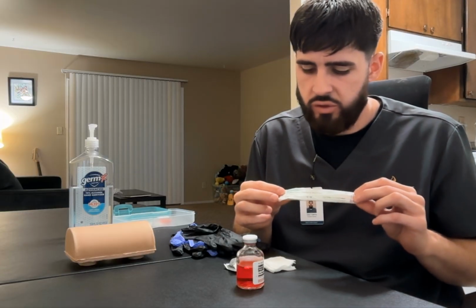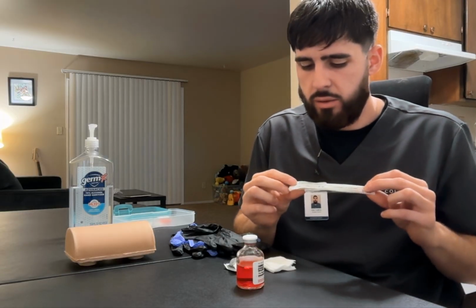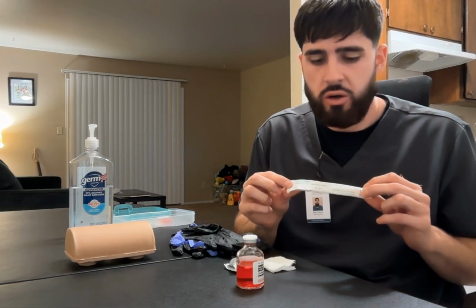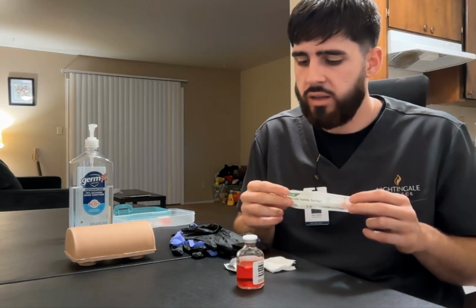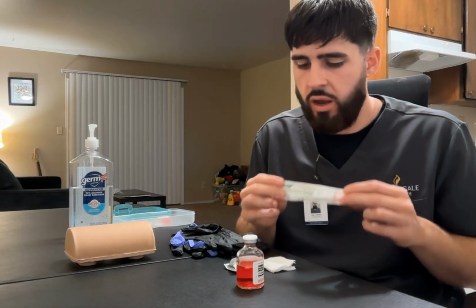Because this is an intradermal injection, I need, of course, my syringe, which is going to be a tuberculin safety syringe. It is measured up to 1.0 ml, 25 gauge, 5/8 inch, which is the correct and appropriate size syringe for this injection.